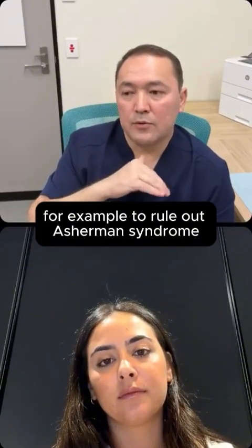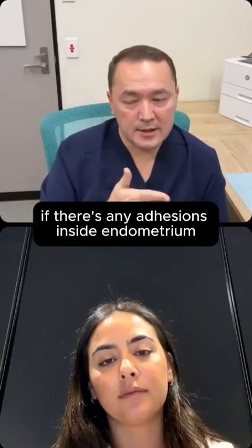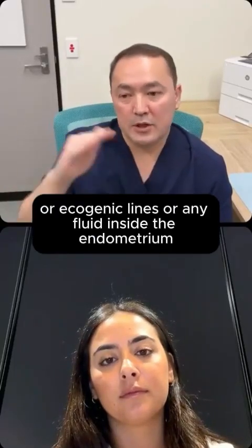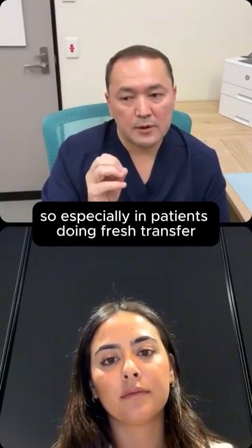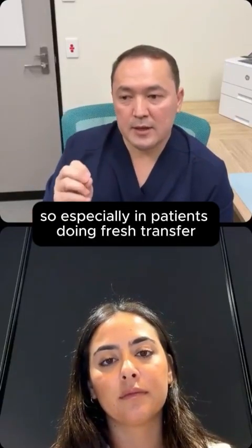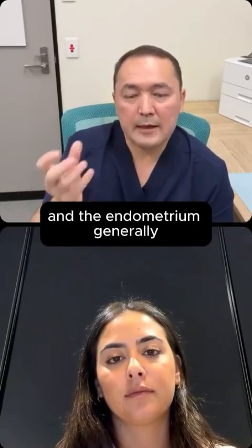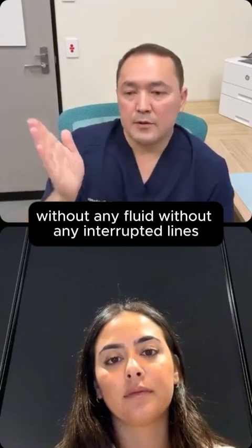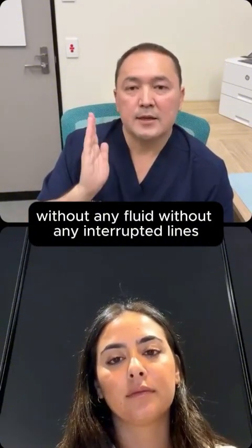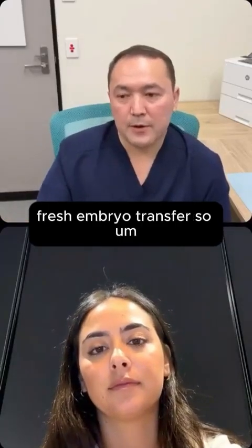For example, to rule out Asherman syndrome, we need to check if there are any adhesions inside the endometrium, or echogenic lines, or any fluid inside the endometrium. So especially in patients doing a fresh transfer, we need to make sure the endometrium is optimal. Generally, we want the endometrium to be more than 7 millimeters, without any fluid, without any interrupted lines, so that we can do a fresh embryo transfer.